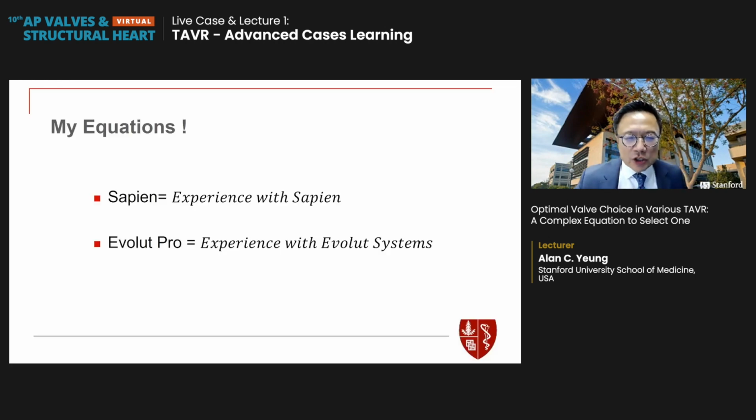In conclusion, my equation is pretty simple: for the SAPIEN valve, you have to have experience with SAPIEN. If you have lots of experience with the SAPIEN, you could actually do most of these patients with the SAPIEN valve. Just like Dr. S.J. Park has a small annulus, we thought you might need a self-expanding valve. Clearly, he achieved great results with the 20mm SAPIEN valve by selecting the right type of patients, the right technique, and implantation height and depth.